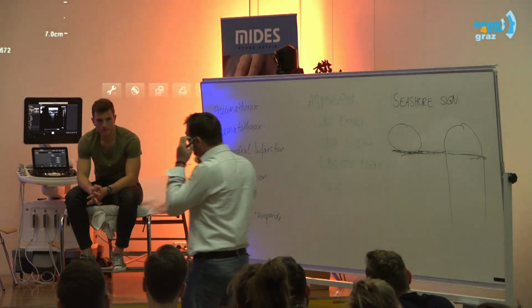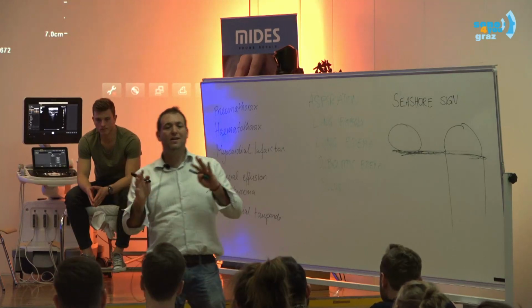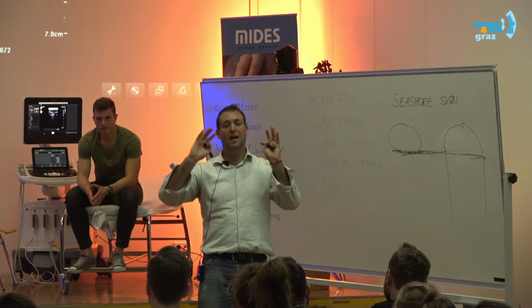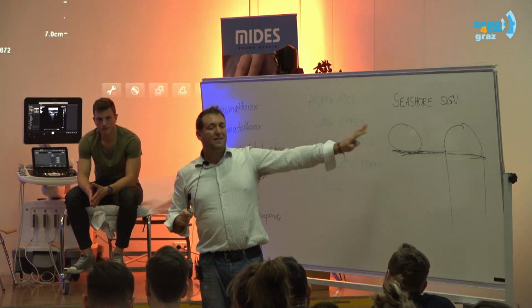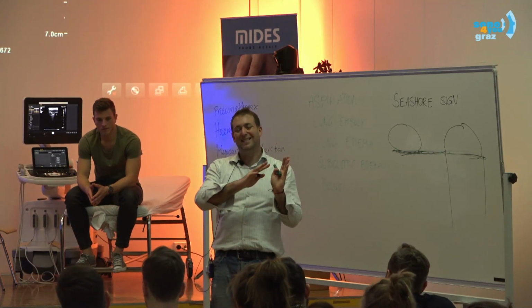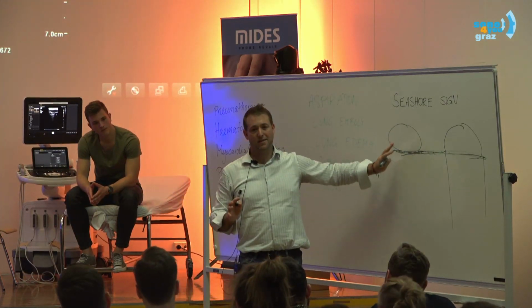And this is very important to know so that we can interpret images later on. So what I wanted to highlight here is black and white. When you are describing the ultrasound picture, you may say, this is black, anechogenic, echogenic, hyperechogenic, so forth. But that description is not automatically interpretation. This is the rib, this is the shadow.